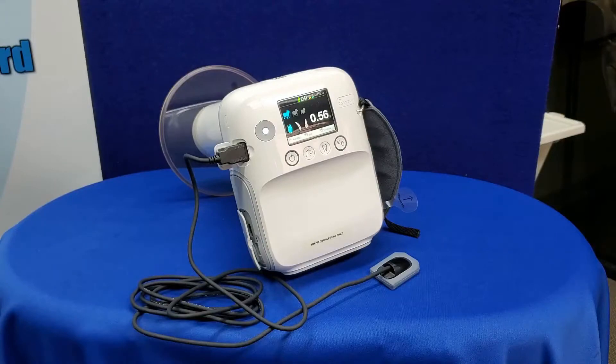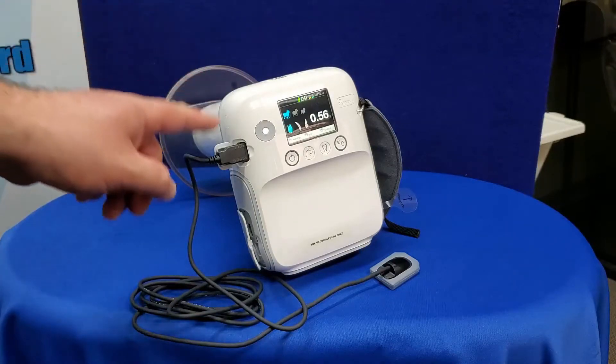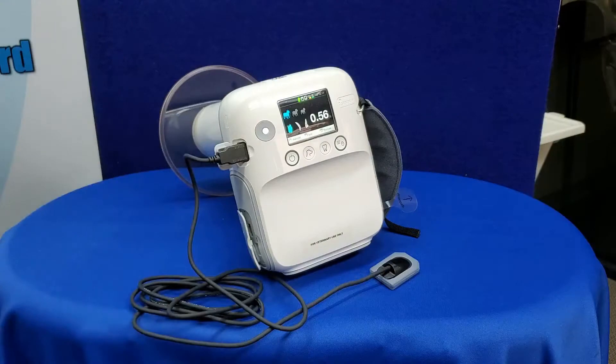The PortView intraoral sensor comes in standard sizes 1 and 2 and is designed to be as ergonomic and easy to use as possible. The USB connection on the sensor allows you to easily connect the sensor to a PC or the PX4 generator, allowing for three different configurations for image capture.